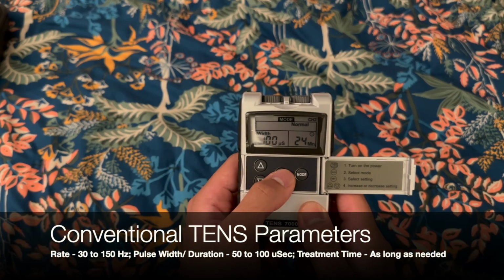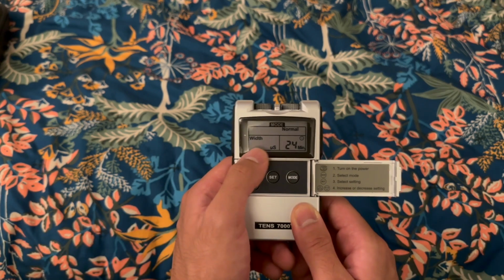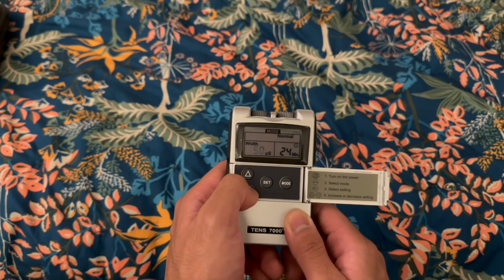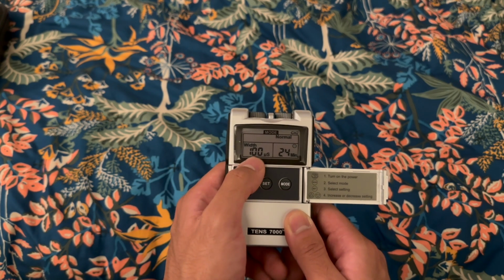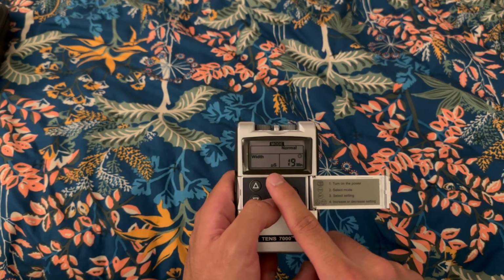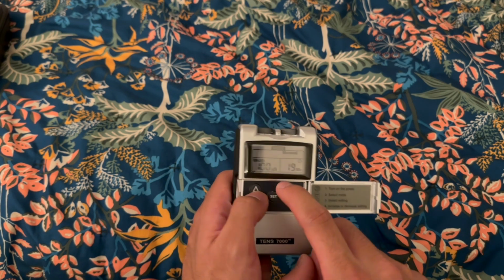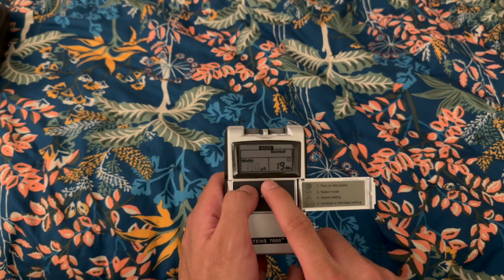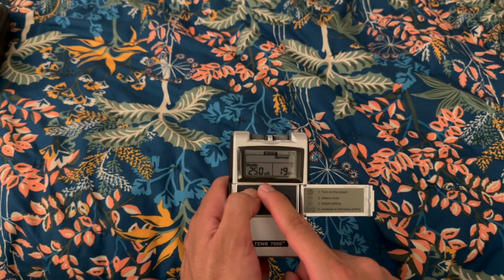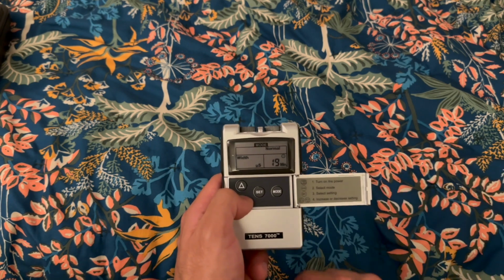With the parameters to set it up to get that type of treatment with conventional TENS, we'll press set. Our width is flashing, and these numbers will be between 50 to 100. So we'll just leave it at the 100 that it was at originally. Regarding pulse width or pulse duration, measured in microseconds, it's going to be very, very brief, along with it being the higher the number, typically the more muscles are felt to be contracted. So we can go all the way up to 300 and it feels like it's hitting much more muscles with much more depth.